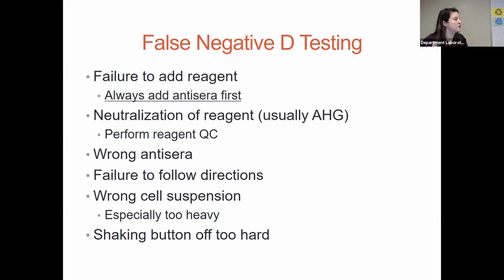If your cell suspension is too heavy, that would be too much antigen. And then if you shake your button off too hard, of course.